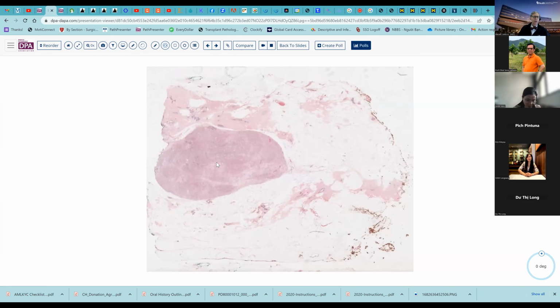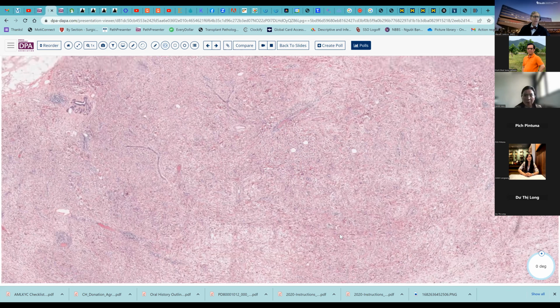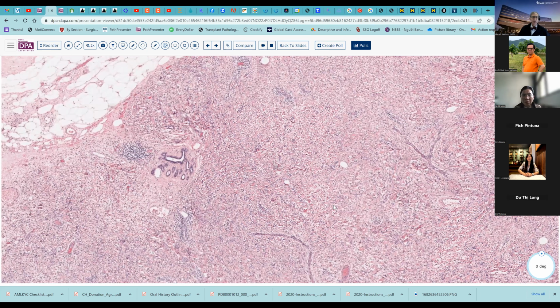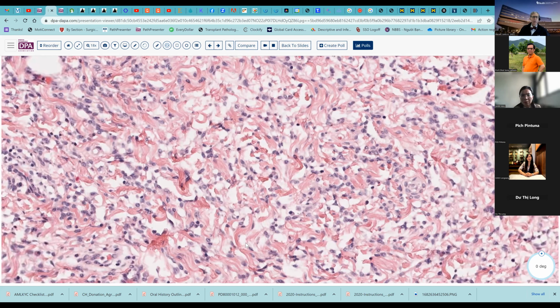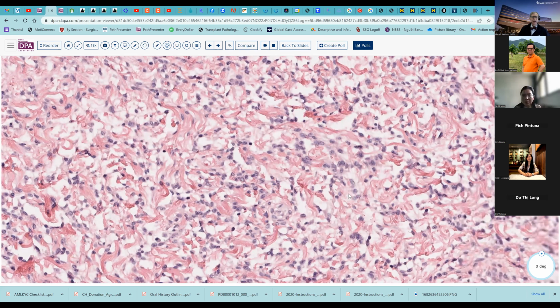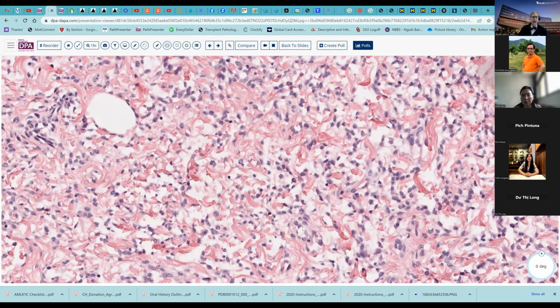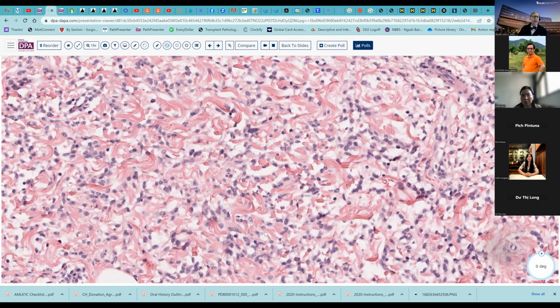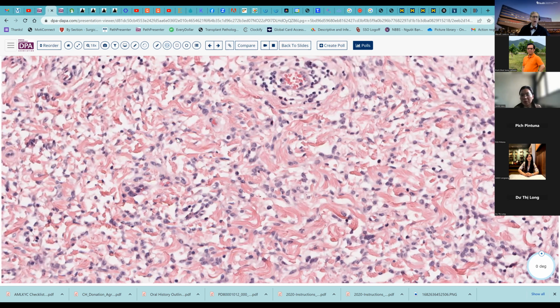And another example, here one that sort of encompasses breast parenchyma or infiltrates around it. And again, a very kind of ropey collagen appearance. So this lesion, I think as we indicated, can look a lot like solitary fibrous tumor, but it would be STAT6 negative, and you would have lost the RB marker.